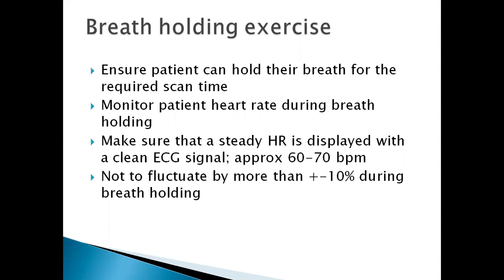So you need to go back in the room, talk to the patient, calm them down, and try again. You keep trying, and if it's not helping, then you have to call the referring doctor. You may ask them to administer some beta blockers. However, there are certain patients who, because of certain pre-existing conditions, the doctor may say, for that patient, I can't administer beta blockers.